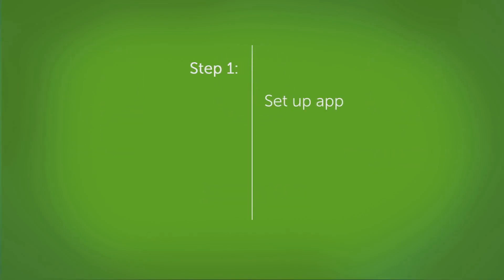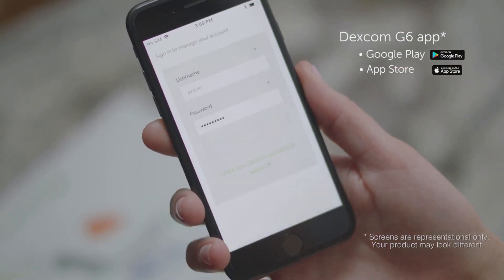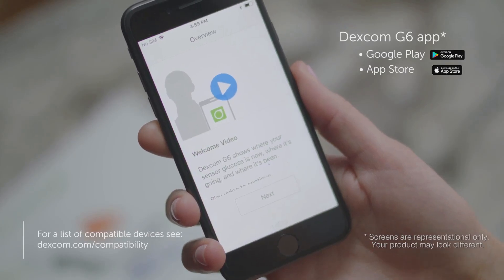First, let's set up the app. Download the Dexcom G6 app. If you have the G5 app installed, delete it before installing the G6 app. Then log in. If you have created an account with Dexcom in the past, use that same username and password. If you have never created an account with Dexcom, create a Dexcom account.